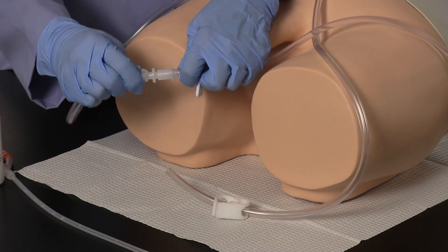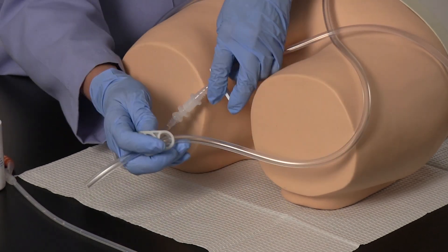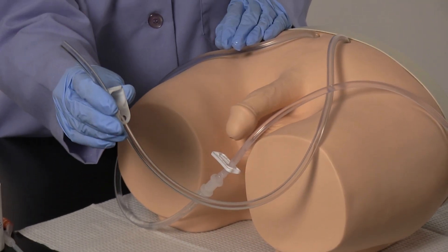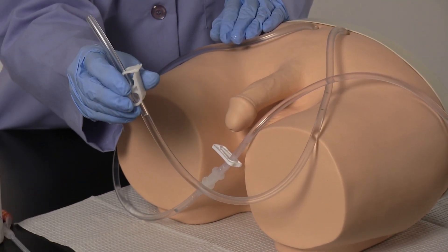Using the quick disconnect fitting, connect the fluid administration set to the simulator. To fill the simulated bladder inside, open both the slide clamp and the pinch clamp, allowing water to flow through charging the system, and then close the pinch clamp on the drain tube.